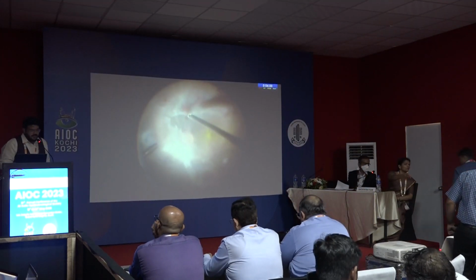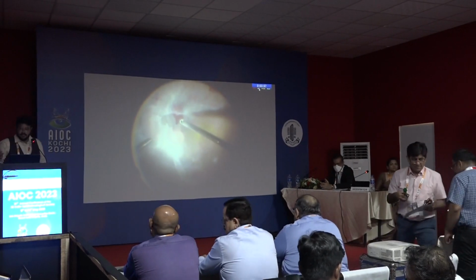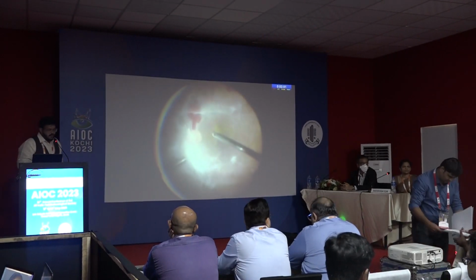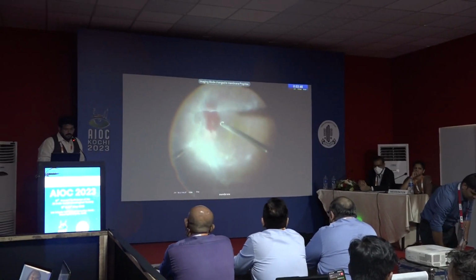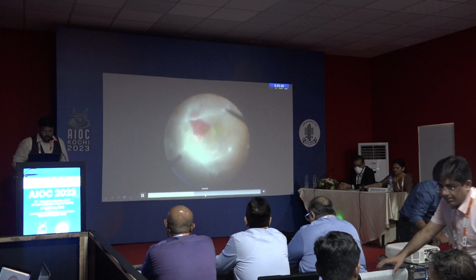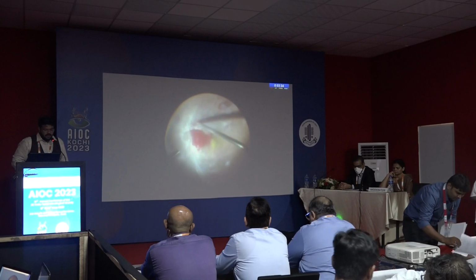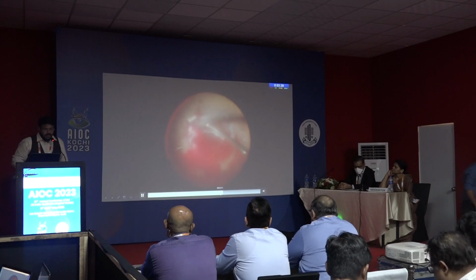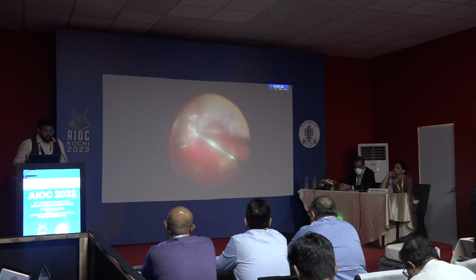Good morning, respected judges and dear audience. So let's look at a routine case of advanced diabetic vitrectomy. As you see, the membranes are being cut and then the bleed starts happening. So we have to go out, get in a cautery to cauterize the bleeder. And then after cauterizing, we'll take the cautery out and then we'll continue. But by the time, as you can see, the bleeding has started from somewhere else and the entire field is filled with blood.